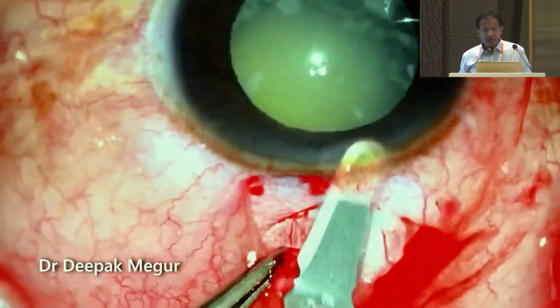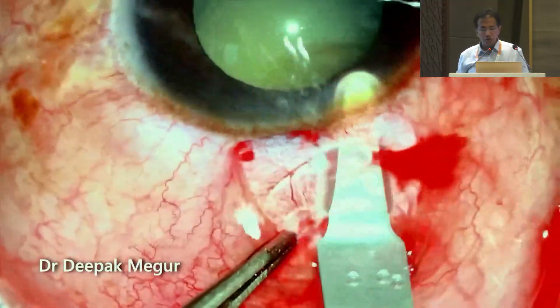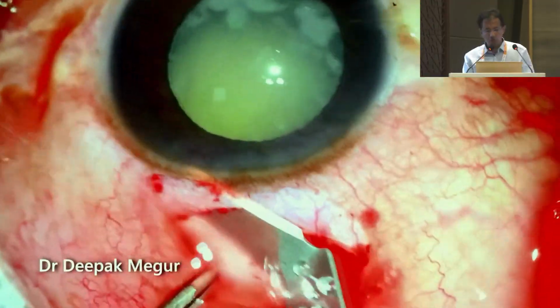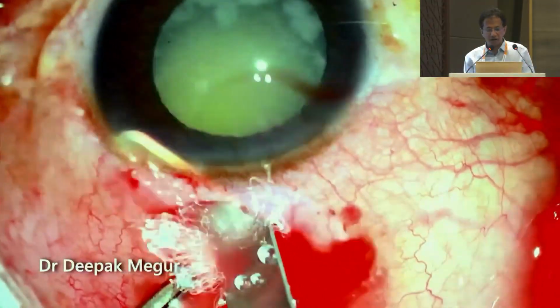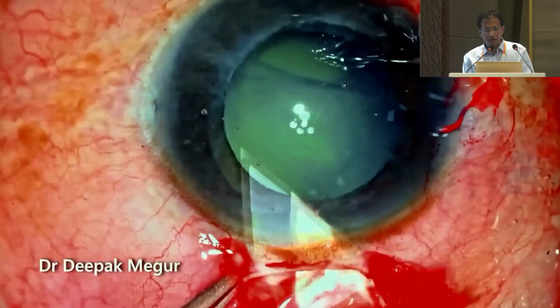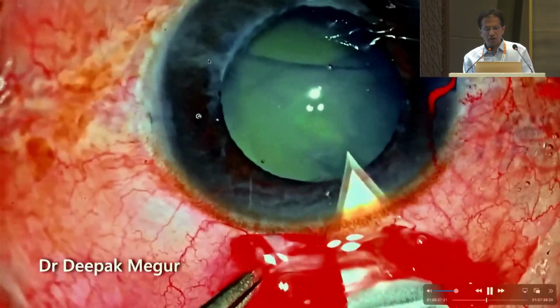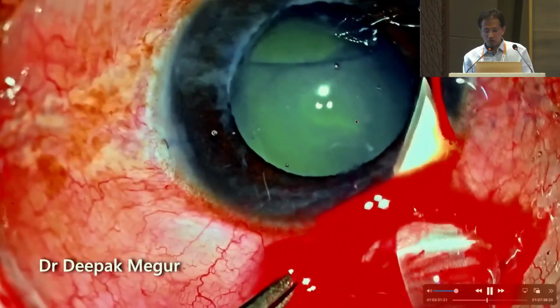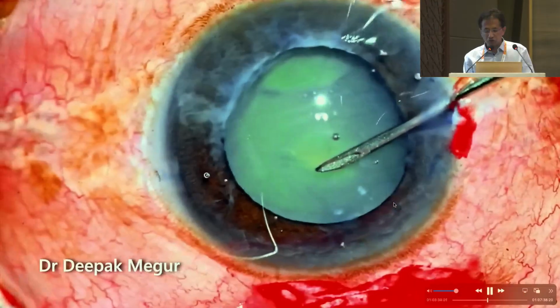So this is another case of a hypermature phacolytic Morgagnian cataract with extremely loose zonules. This is a planned manual small incision cataract surgery in this elderly patient. Again, you can see long-standing inflammation is there. You have to resort to any of the techniques of your choice for doing this.